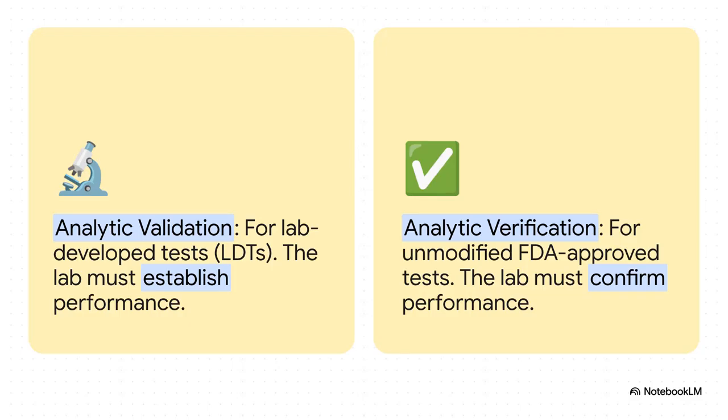Now, here's a really critical distinction, especially if you're a trainee. You need to know the difference between validation and verification. If your lab is cooking up its own test from scratch, what we call a laboratory-developed test, or LDT, you have to do a full-blown validation. But if you're just using an off-the-shelf FDA-approved kit without changing anything, you're just verifying that it works in your hands the way the company says it does. It's a subtle but really important difference.